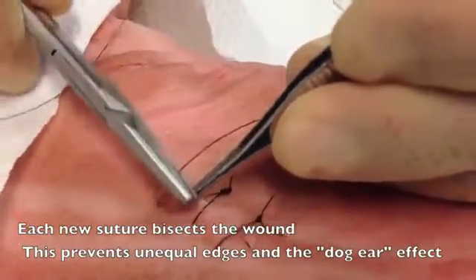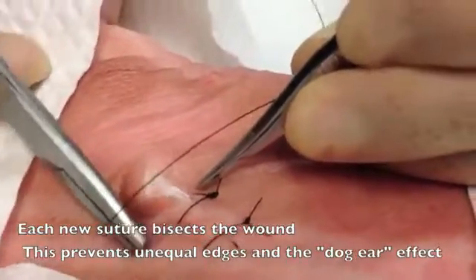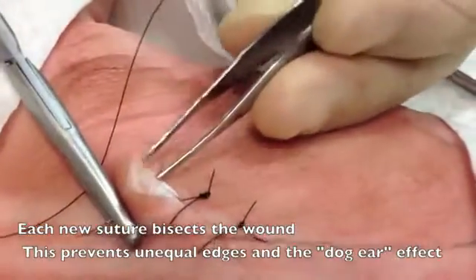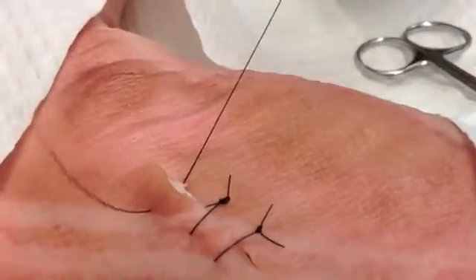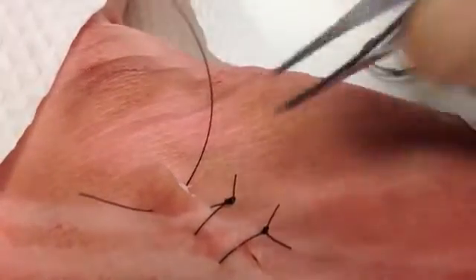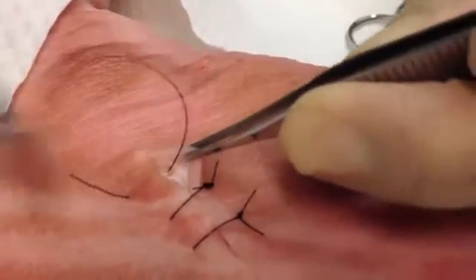Here's a demonstration of further sutures being placed. As you see, every single suture should bisect the previous length of the wound, such that you're constantly dividing the wound and preventing the dog ear effect from occurring.